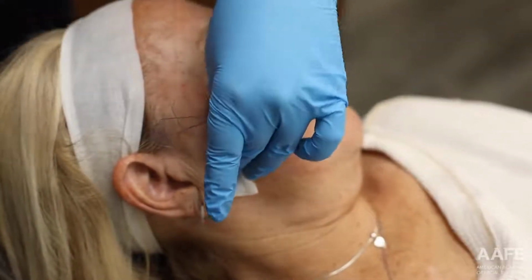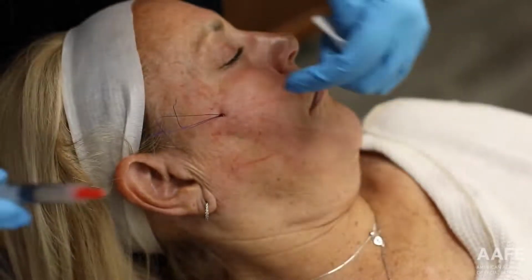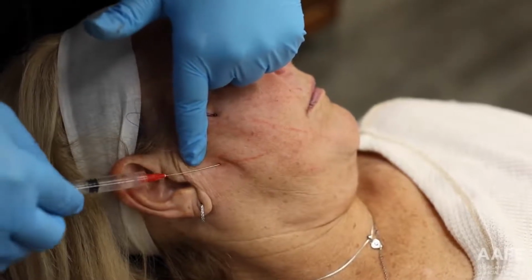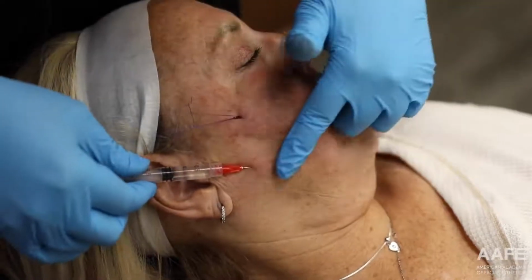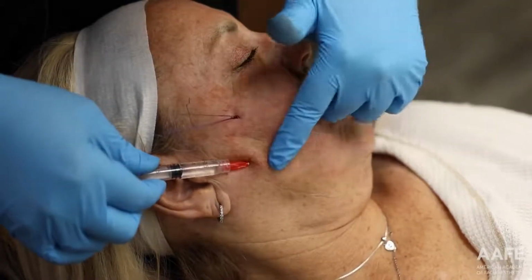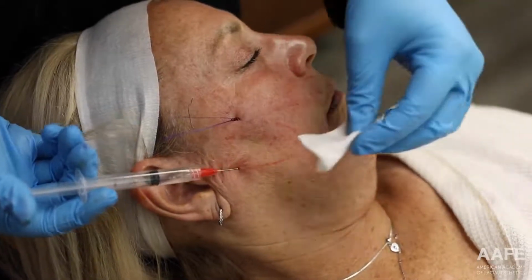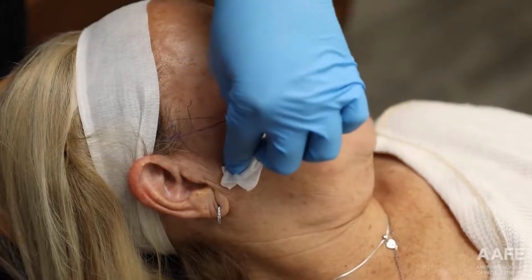Okay, so we just went in with our 18 gauge again. She was previously numbed when I first numbed her, so now she's got an entry point, so I can slip in with the same cannula, 25 gauge, 50 millimeter length. This is a ComfortTox micro cannula. They're really nice. Okay, that feels good. Big burn, last big burn. And again, no more than 0.5 of lidocaine in that vector.